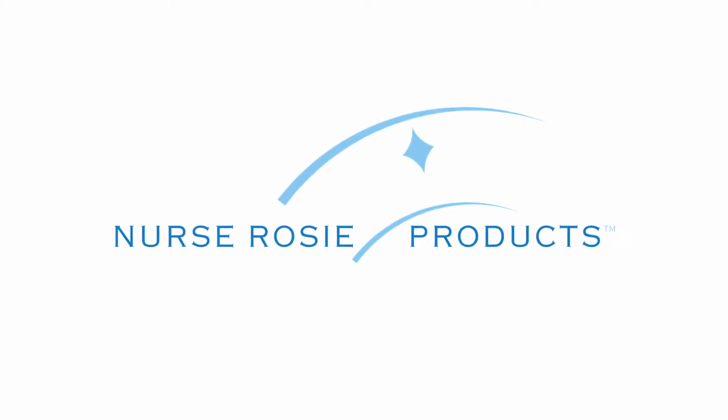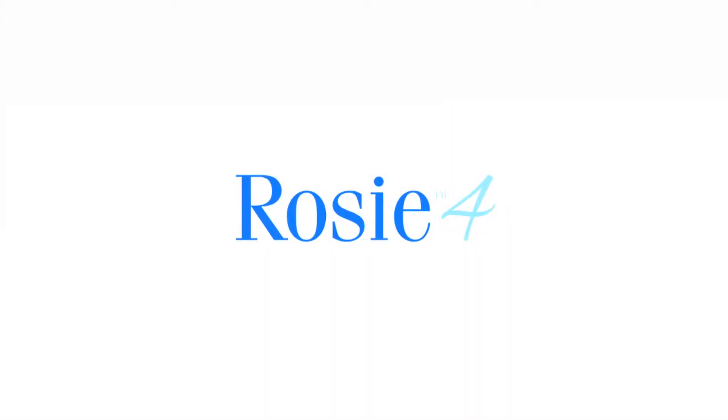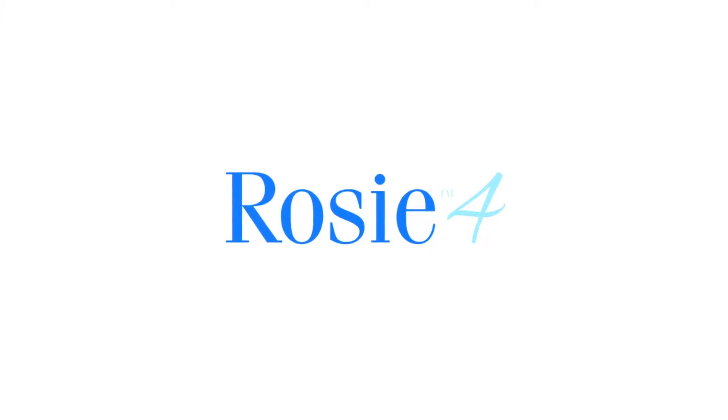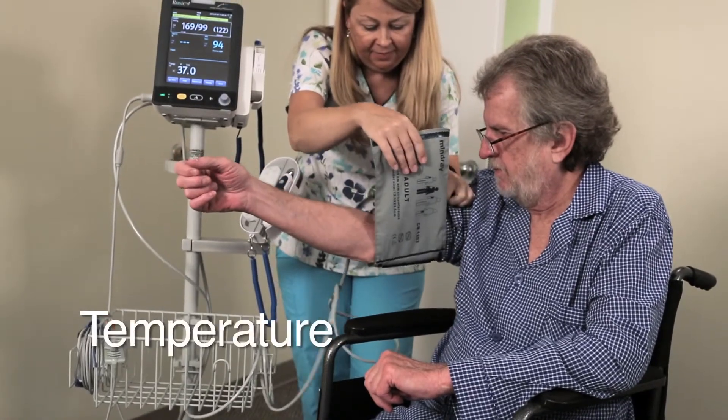Nurse Rosie Products is proud to announce the newest and most advanced member of our Vital Signs equipment team, Rosie 4. Rosie 4 Vital Signs Cart will provide lightning speed results for daily tasks such as NIBP, SPO2, and temperature.